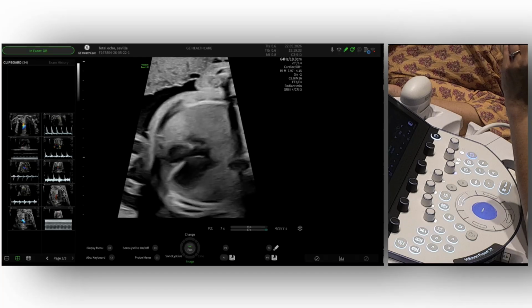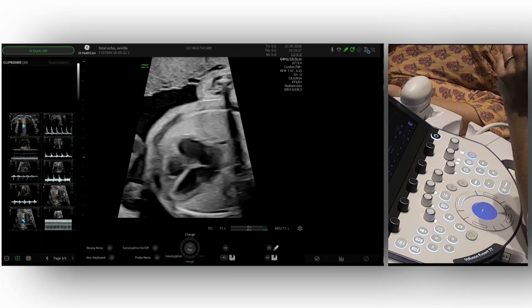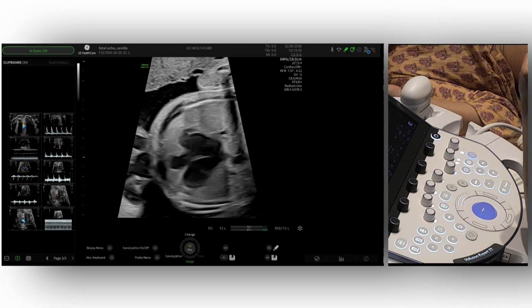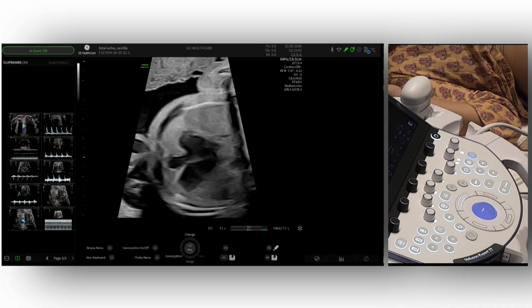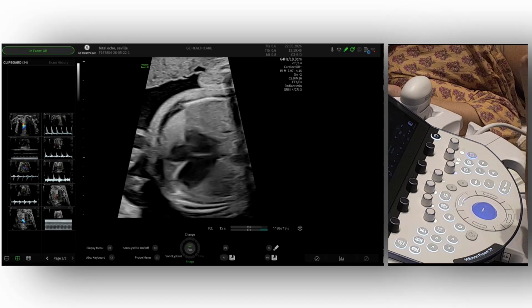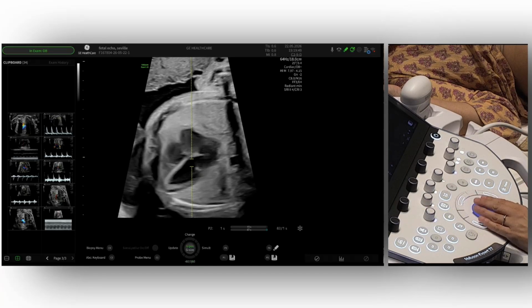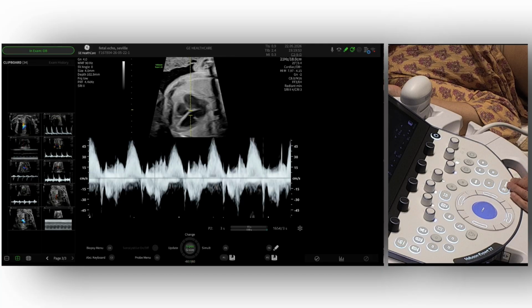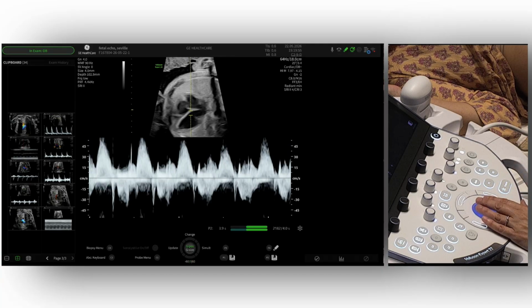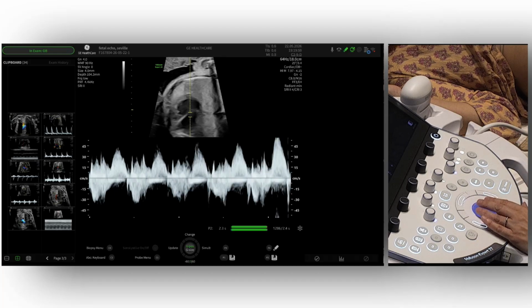It's not that you measure the number, but to see the relation. If you are following a patient with anti-Ro, anti-La antibodies, and you are trying to see if there is maybe a beginning of an AV block, then you can measure this AV relationship that reflects the PR interval.